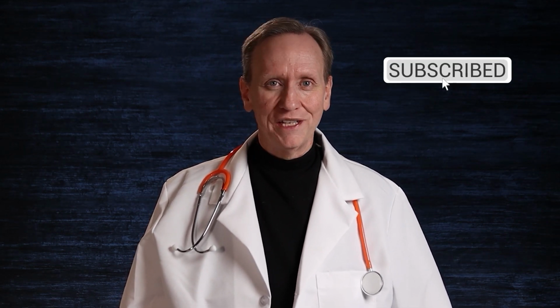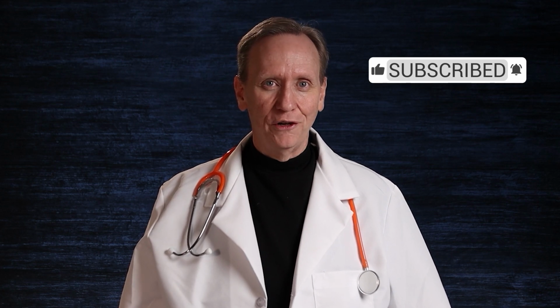So when you have a heart block, yes, it's going to take more time for the electricity to get from one bump to the other on the ECG waveform. So it's going to result in a delayed contraction, but it could also result in a missing contraction altogether. And that's why we get concerned about heart blocks. If the electricity is impeded, not only will it take time, causing some discoordination in the heart, it could actually result in the heart not beating properly, and that means blood's not moving. And the degree of heart block is a degree of severity. So that's why we want to take a look at the first, second, and third degree blocks.